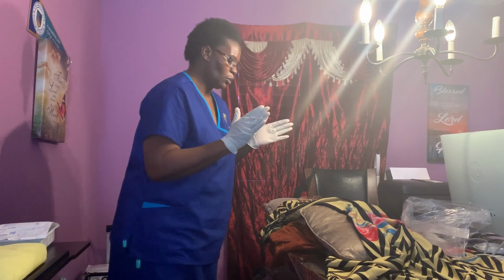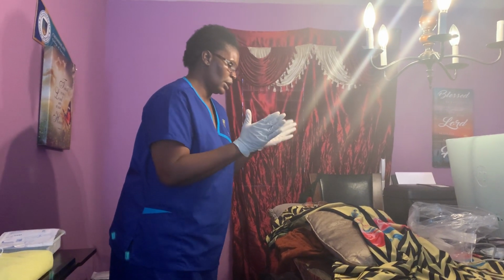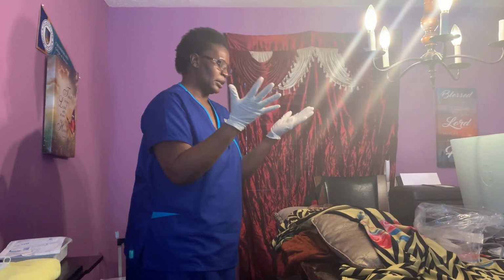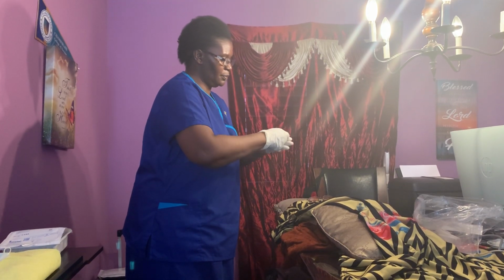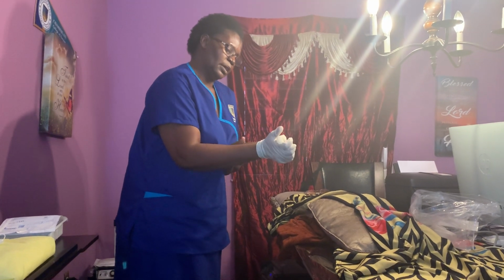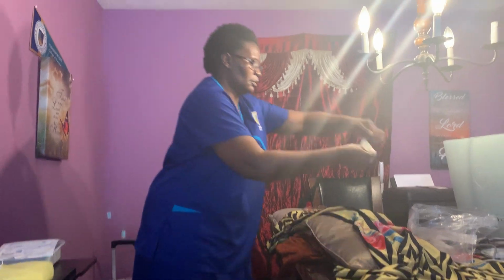So now I've measured it, I know where the tunneling is, so now I'm gonna prepare myself for the wound change. So I'm gonna take my clean gloves off, pinch from the middle, and go from inside and then into the trash.